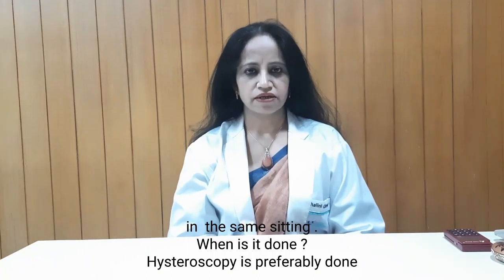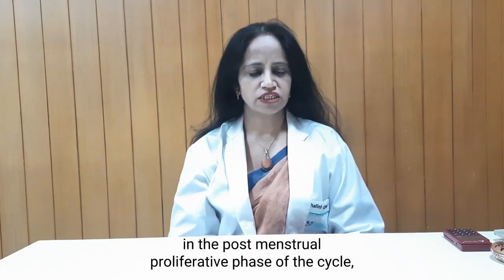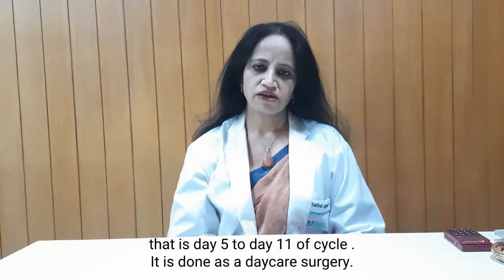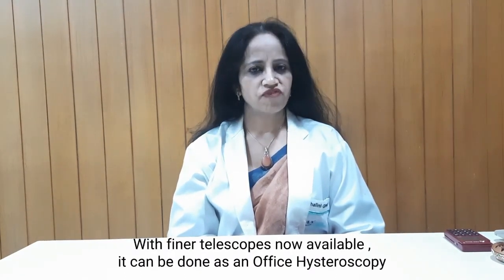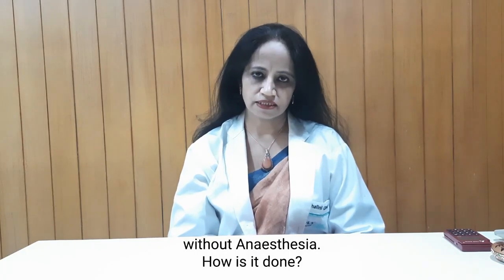When is it done? Hysteroscopy is preferably done in the post-menstrual proliferative phase of the cycle, that is day 5 to day 11. It is done as a daycare surgery. The patient comes in the morning and goes back in the evening. With finer telescopes available, it can be done as an office hysteroscopy without anesthesia.